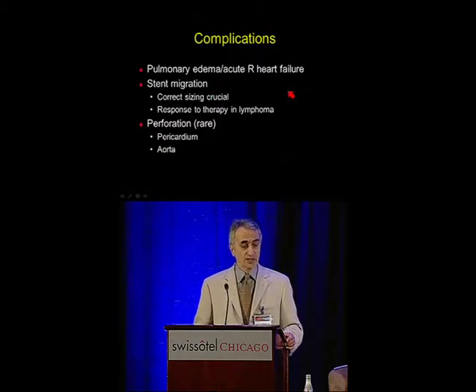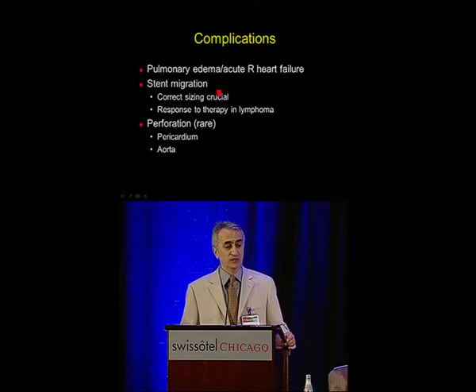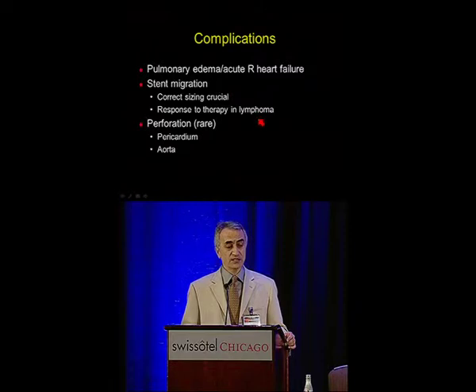Complications: pulmonary edema can occur. Stent migration, really, this is a technical failure. This is a technical problem. If you're undersizing or you're misplacing stents, you have to make sure that you put it in the right place, and in the lymphoma patient, make sure you're not undersizing those stents. Perforation is rare. It can be into the pericardium, into the mediastinum, into the pleural space.